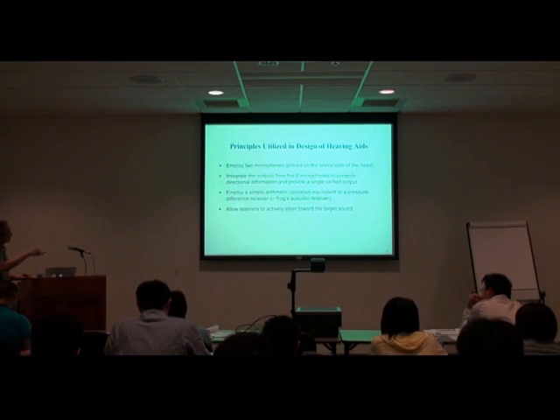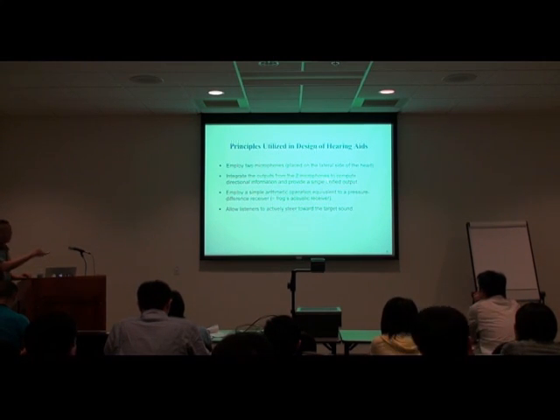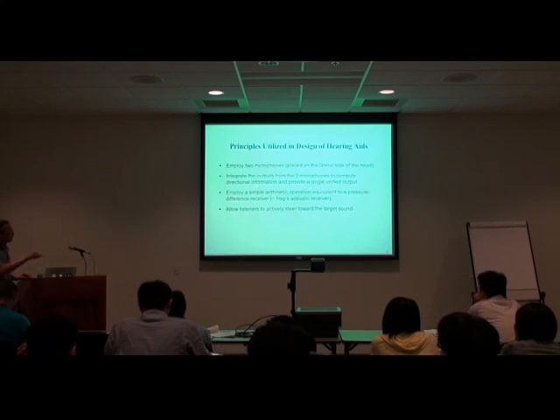And we want to integrate the output to form a single unified output. We are going to try first using a very simple arithmetic operation. That is equivalent to a pressure difference receiver, because the push-pull receiver is basically a subtraction algorithm in an acoustic receiver. We want to try whether or not that is successful.